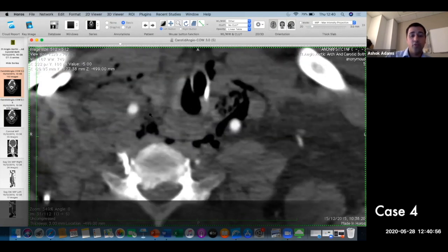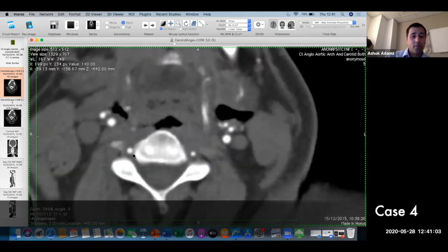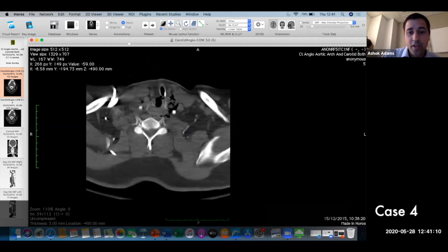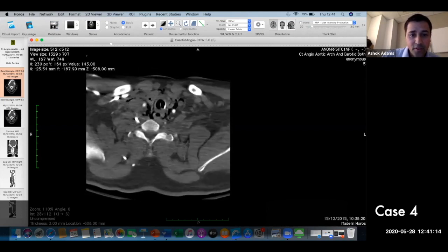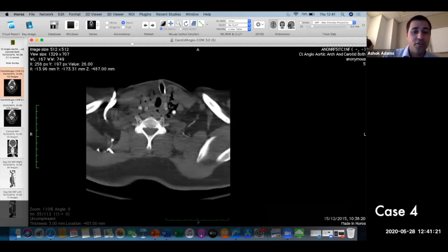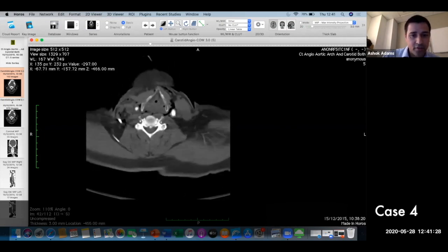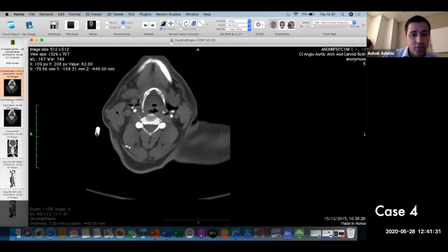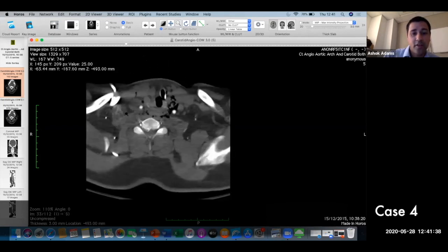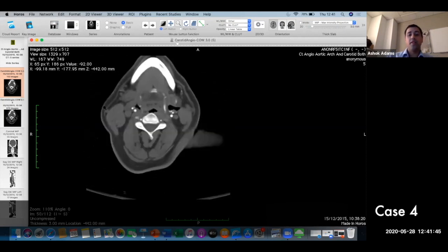Don't forget to follow the right vertebral artery as well - many patients have multiple neck wounds. In the report for this case: breach of the visceral space with potential injury to thyroid gland and esophagus - keep the patient nil by mouth and arrange a water-soluble contrast study to assess for esophageal injury. Laterally in the posterior cervical space, gas has tracked out with some locules around the sternocleidomastoid indicating a muscle injury. Once you know your neck spaces, you can give a much more detailed and accurate report.